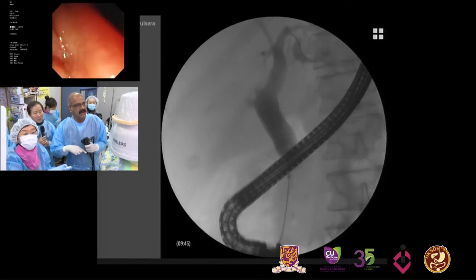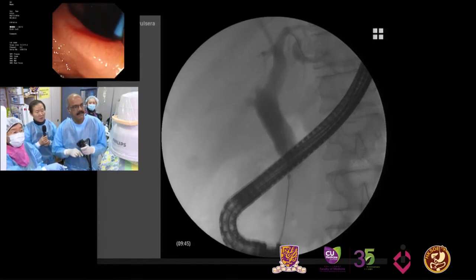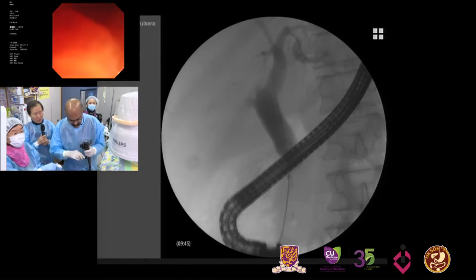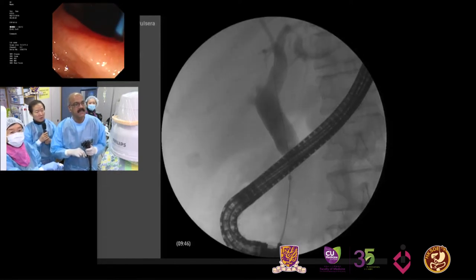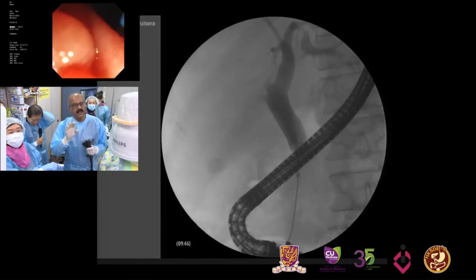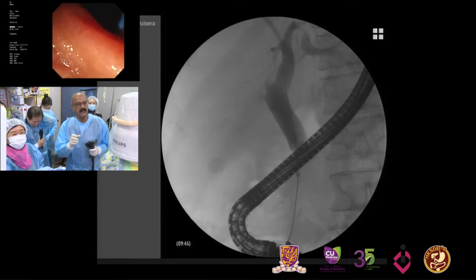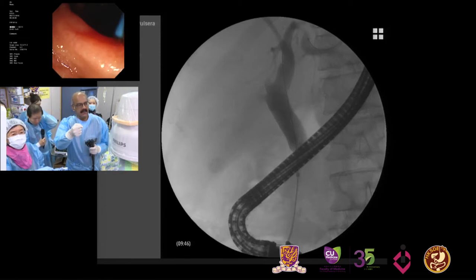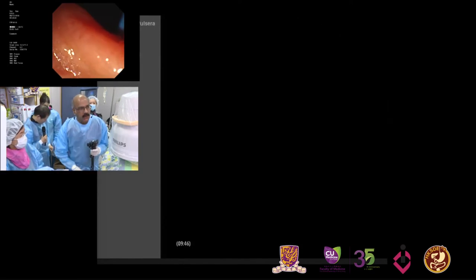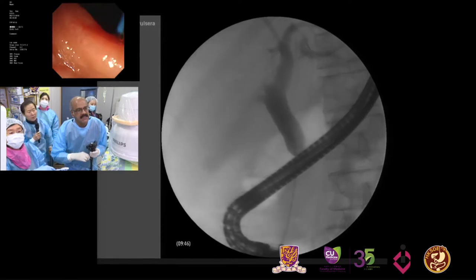And you can see that we'll require at least 2 minimum sessions, like Duong Van suggested. So you place it just at the proximal tip of the stricture? Just at the proximal tip, exactly. Because the reason is, if you place it too much into the bile duct on the top, if it's free, the impedance level goes up to high levels. You don't get the current. So it has to actually hug the stricture completely. So that's why I don't want to see the top part. You see very carefully. You have to put it just at the top of the stricture.